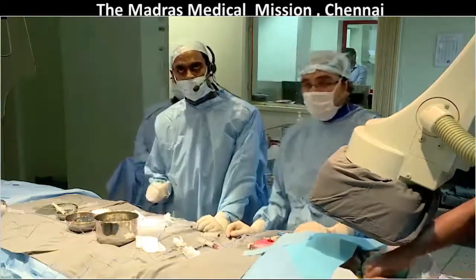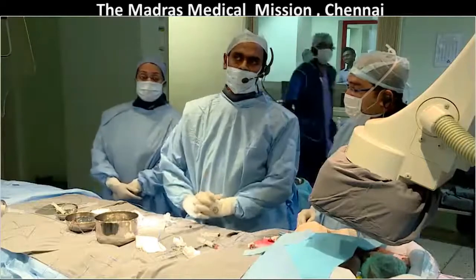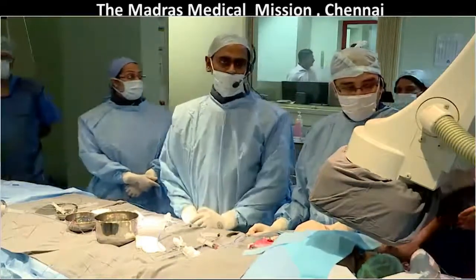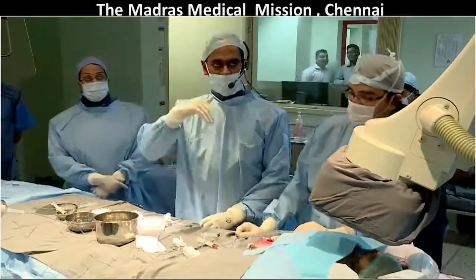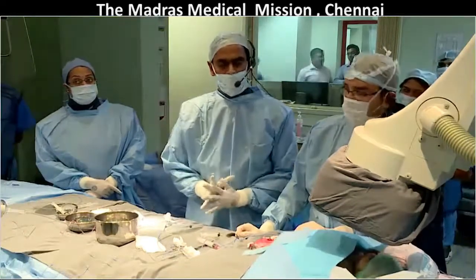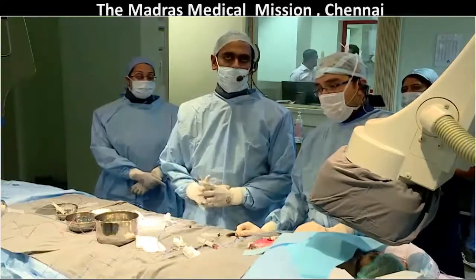So, before you go on any further, I'm confused. Do the pulmonary veins drain normally to the left atrium in this patient? Correct. Actually, the anatomy that was present was a window-like communication between the undersurface of the right pulmonary artery to the roof of the left atrium, which causes a shunt of the blood from the right pulmonary artery directly into the left atrium. When we saw it in the fetal period, the pulmonary artery had very high pressure, so we had a high gradient.